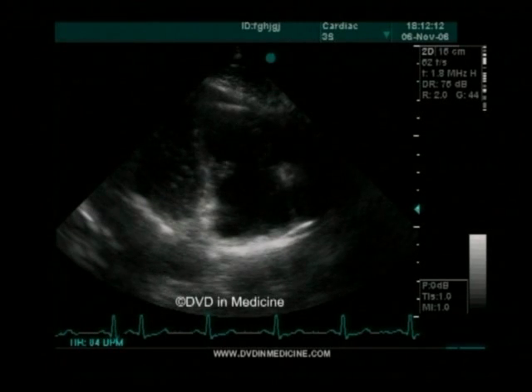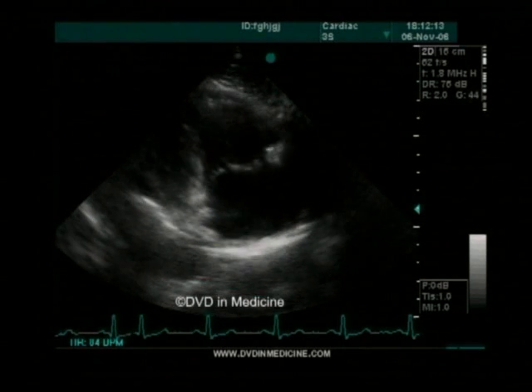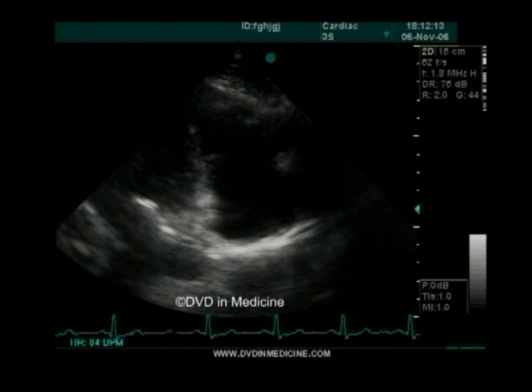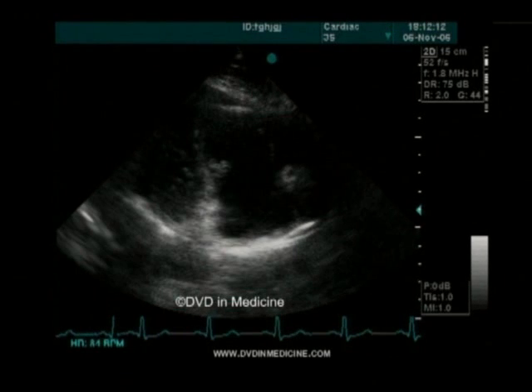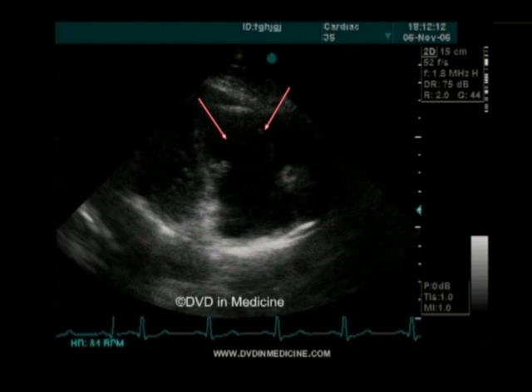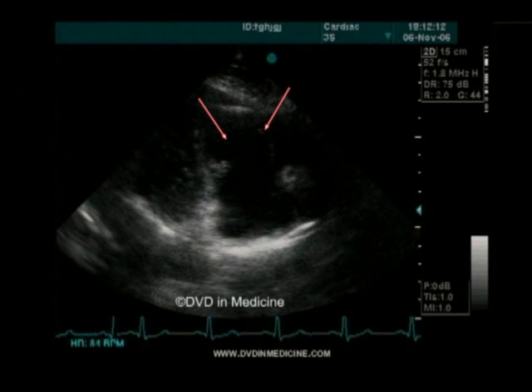Normal tricuspid valve leaflets open in the same manner as mitral valve leaflets — double motion: open, close, open. Normal tricuspid valve leaflets should open like a door, so the tips of the tricuspid valve leaflets have the biggest amplitude.